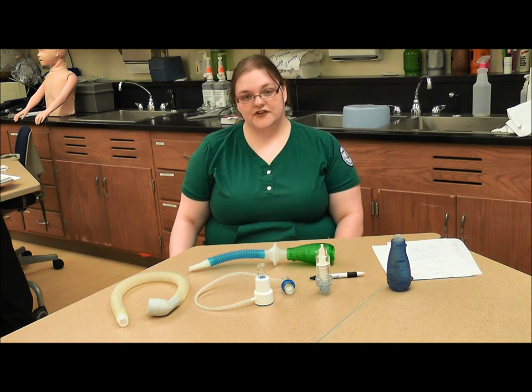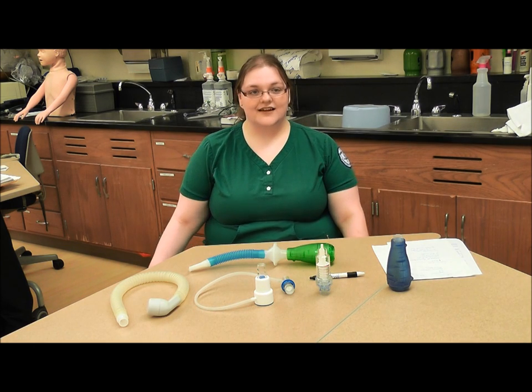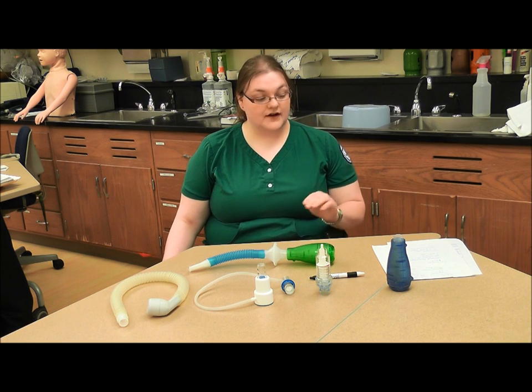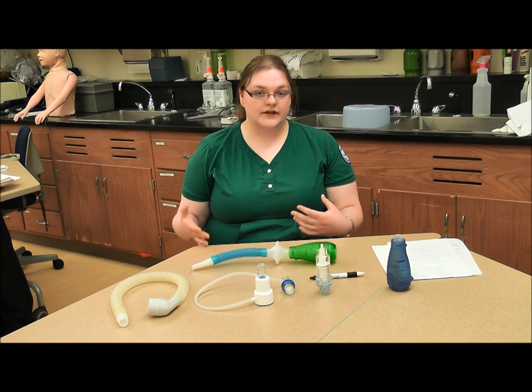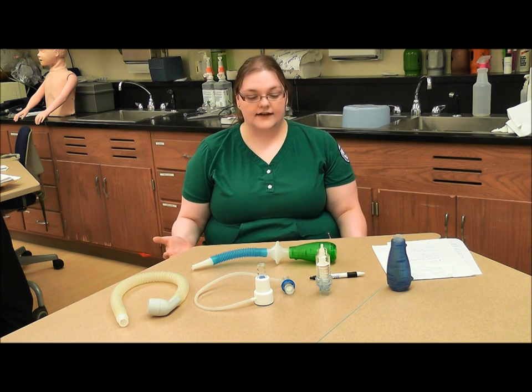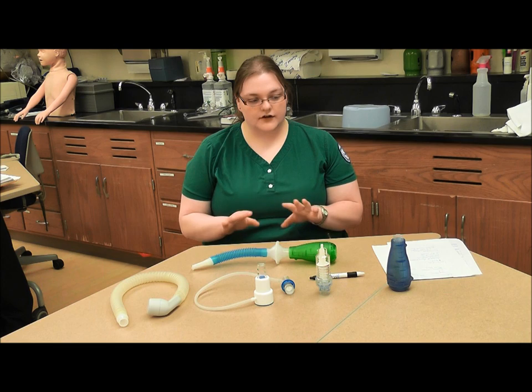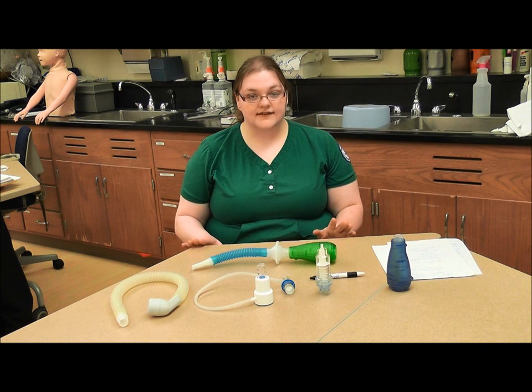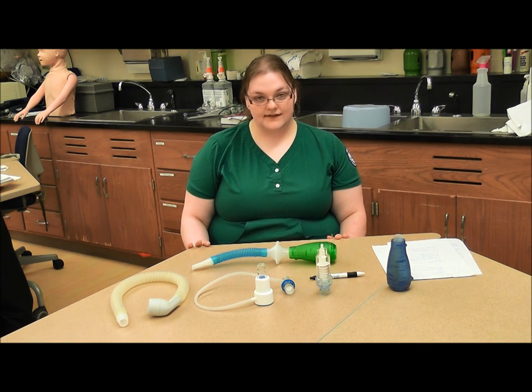Use your judgment. If you think your patient is too dignified to do the chicken huff, try to explain it to them in the best way you can. So you do two to three huff coughs for every 10 to 20 breaths into your device. Take a pause so you don't hyperventilate or get lightheaded, then start the process all over again. You're not going to do this for more than 20 minutes cumulatively — it's unnecessary to do it longer than that. Your patient should do this every couple of hours at least.